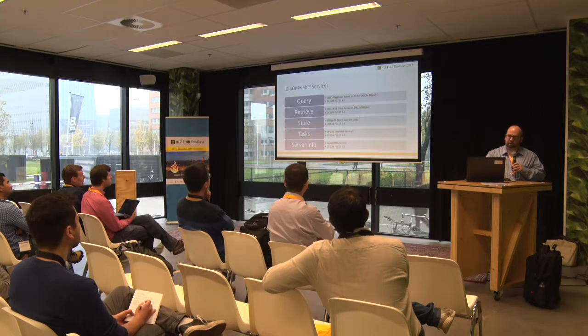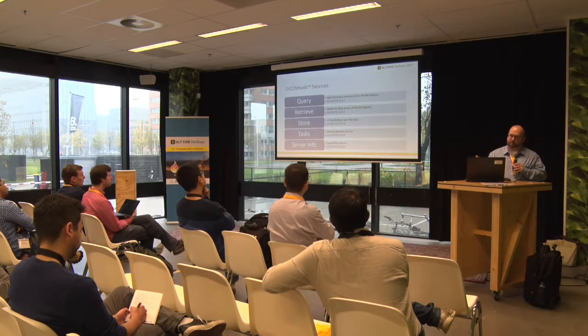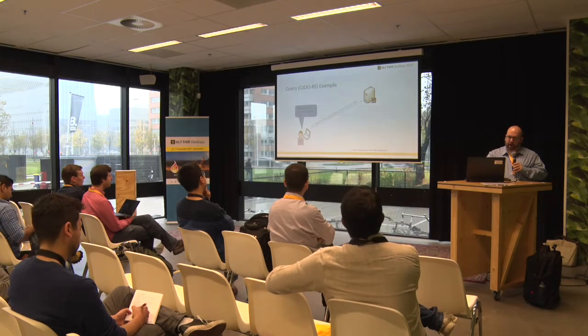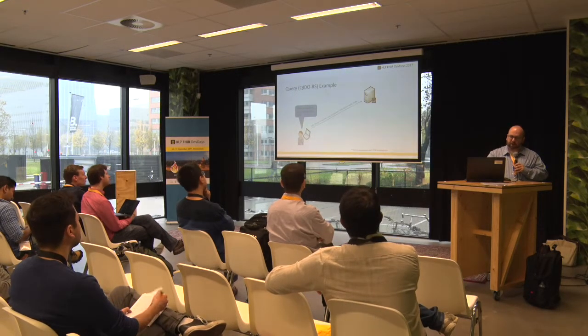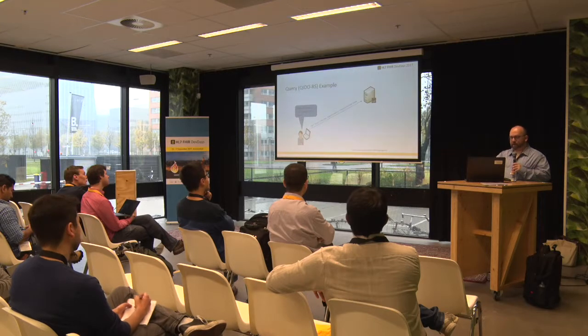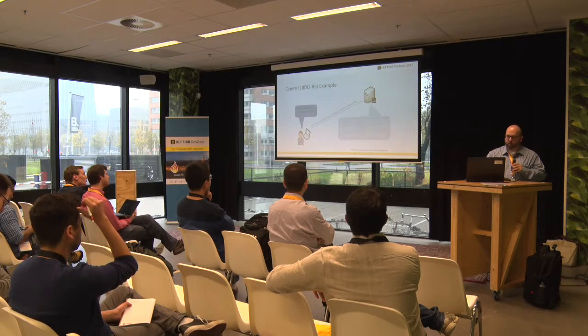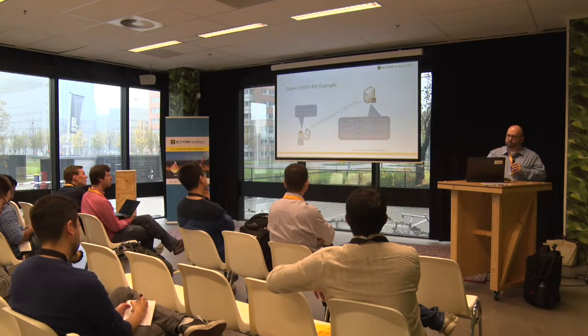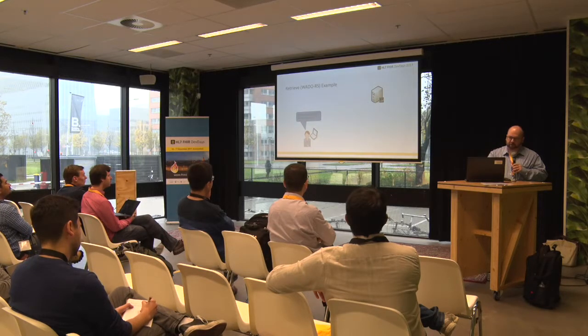There are 5 services: query, retrieve, store, tasks, and server info. And really quickly on how they work. So for query, I pass this RESTful query where I'm on the studies resource. I would like to get all of the studies for John Doe. There's that 1010 tag where I pass that forward, and I get back a list of studies. We have some exercises that we'll do at the end of the session with Mohammed, which will walk us through some of these really quickly, so I won't go into too much detail.